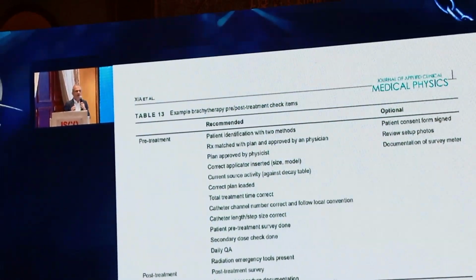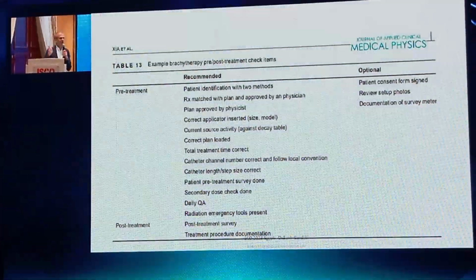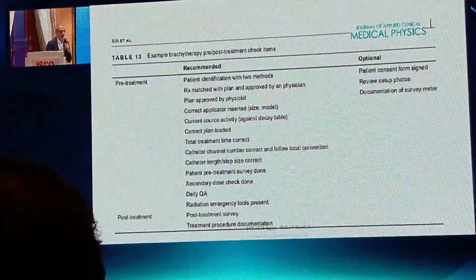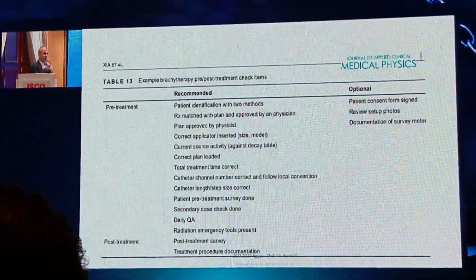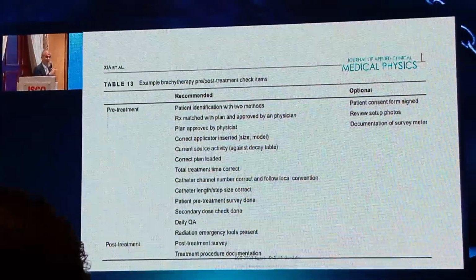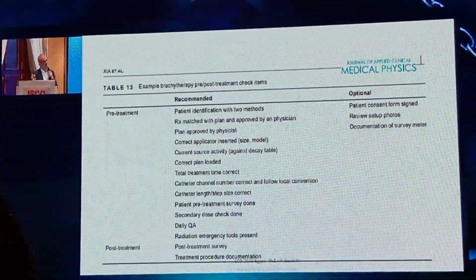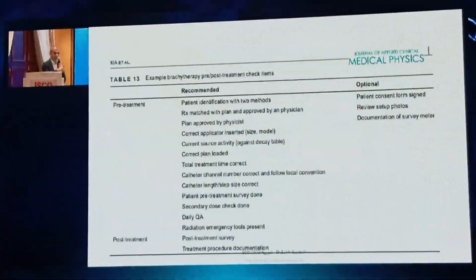Yes. Thank God, the nurse came all of a sudden saying, sorry, I forgot to tell you. She had the PET-CT procedure a couple of hours ago. Thank God, we had an explanation. But don't forget to scan the patient. We should have scanned her before the treatment. That was our issue. We changed the procedure. We started to do the survey before the treatment. Scanning first and then loading sources.